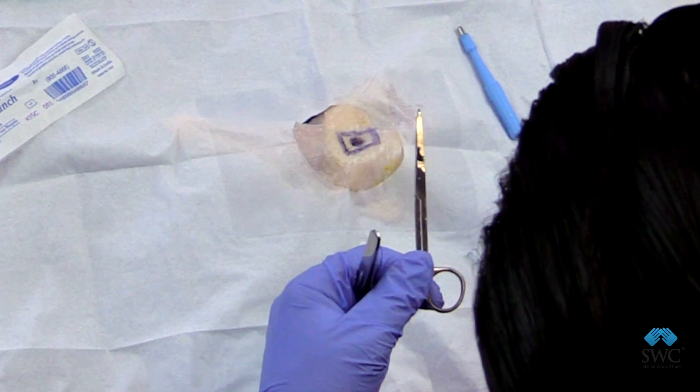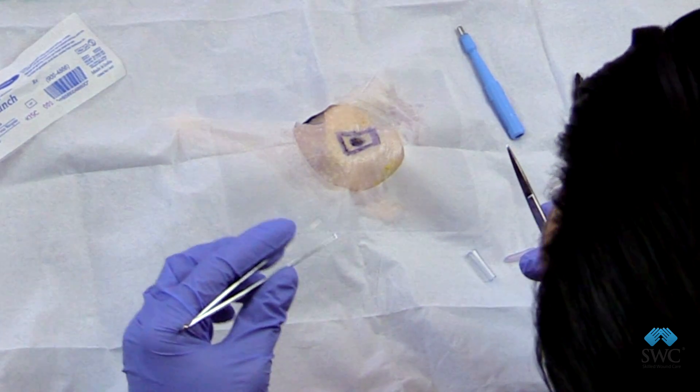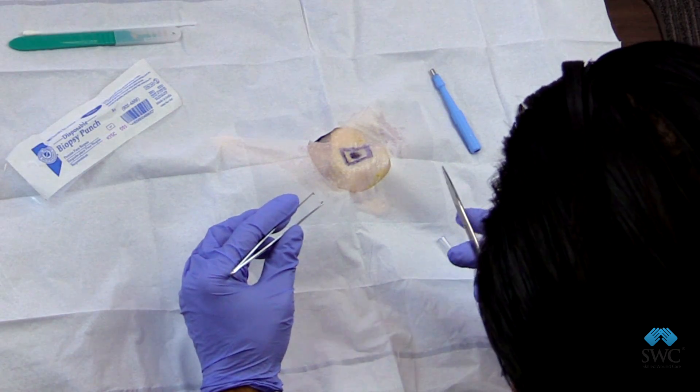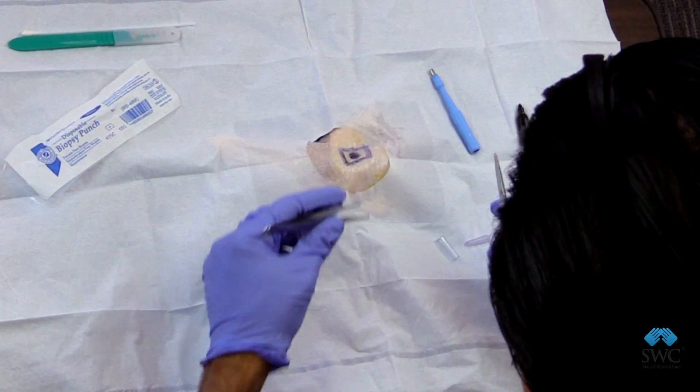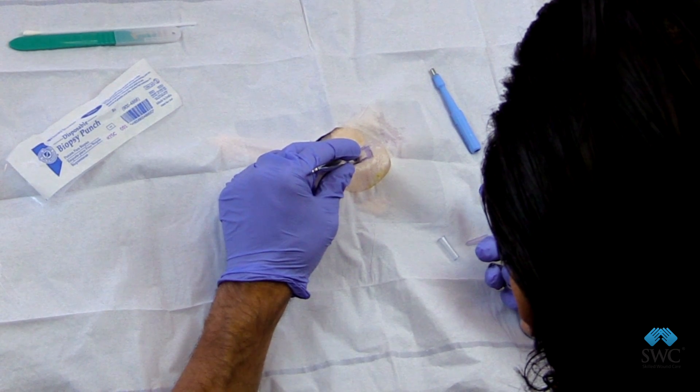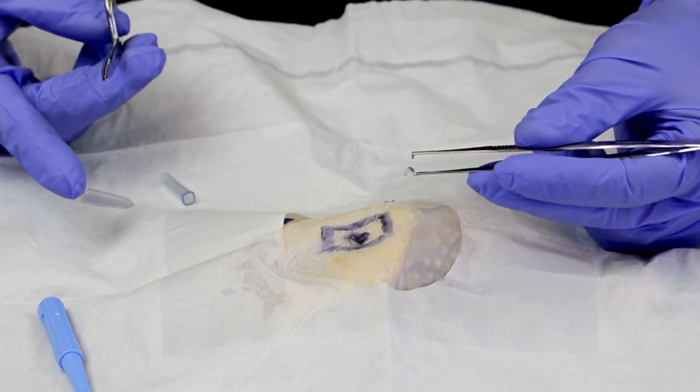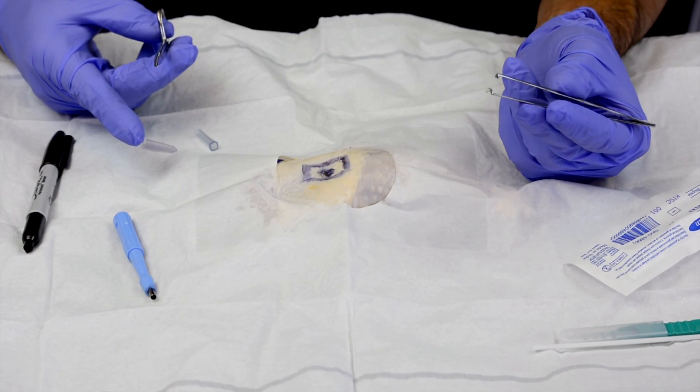I'm going to get scissors and tissue forceps. The key is, for demonstration purposes we have a tooth forcep, but you want to get something that is very gentle. Go ahead and grab the tissue itself and bring it out, and here it is.